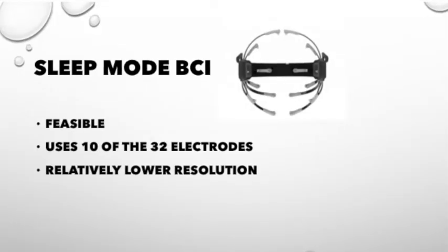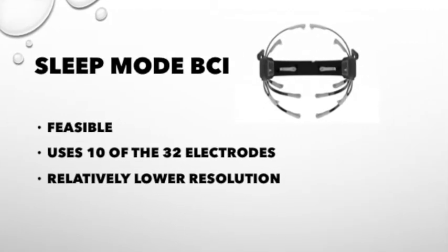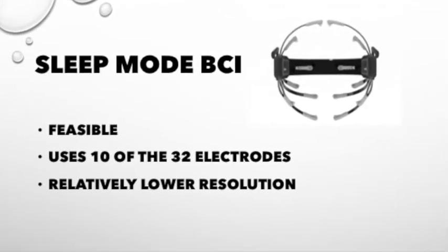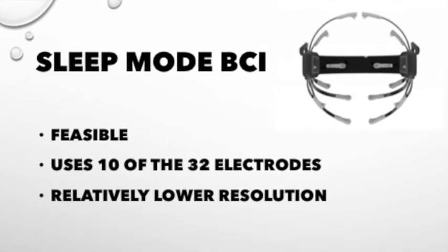Based on the current capabilities of BCI devices, our device is relatively feasible. It only uses 10 of the 32 electrodes, thus slightly decreasing the error associated with electrode placement. Some limitations of our device are lower resolution because it is non-invasive, and noise due to signal interference.